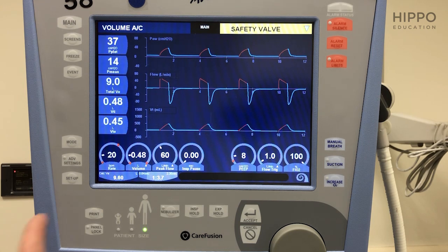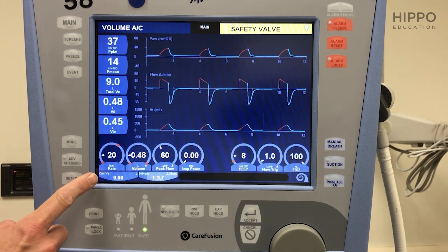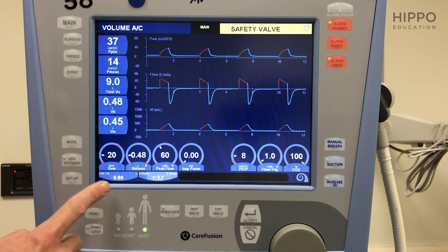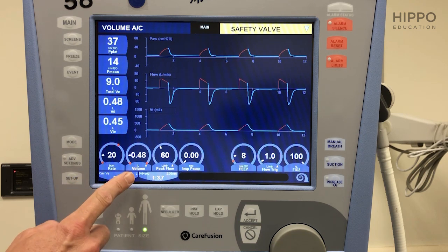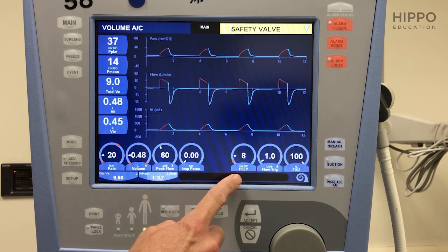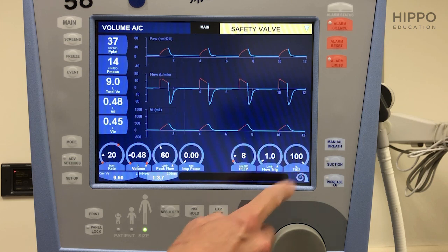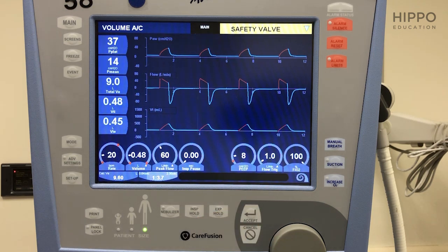They're going to be down here at the bottom. The first one being respiratory rate, followed by tidal volume, PEEP, and FIO2. Let's run through how you would adjust those.